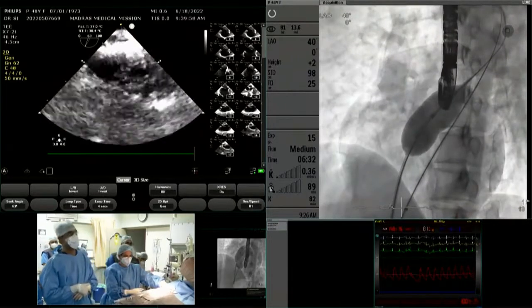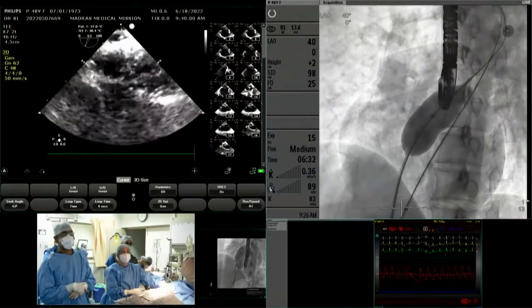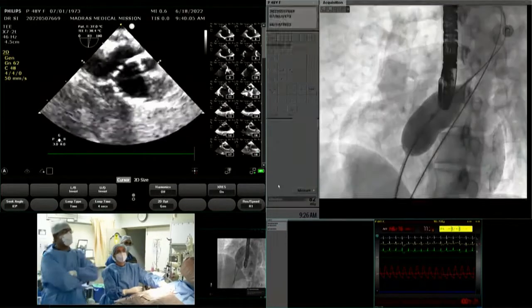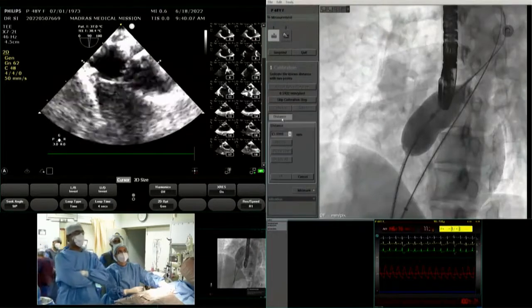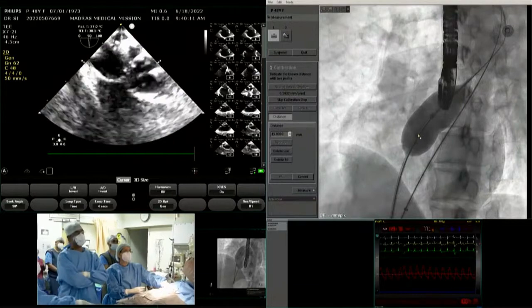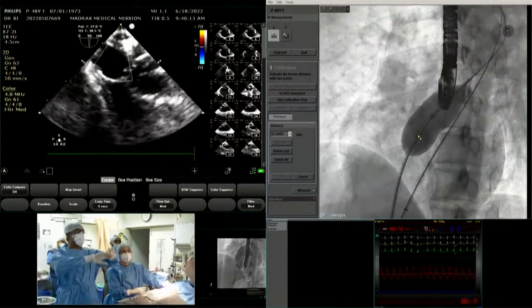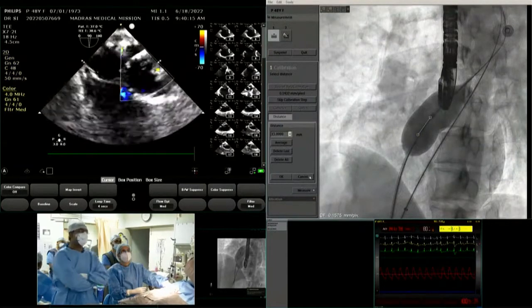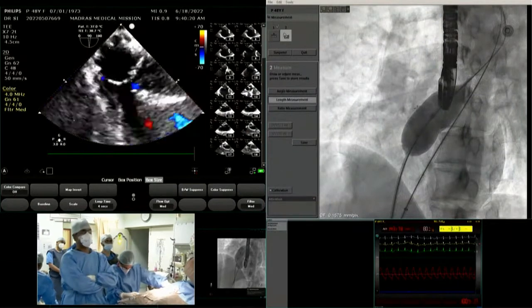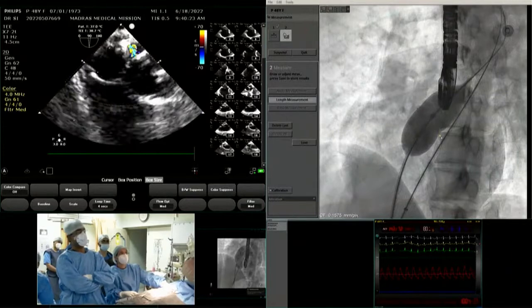Can you show in 90 degrees? Because the entire heart is occupied by two balloons, we can't see the interatrial septum. Can you show in multiple views, 90 degrees? Pramod, 90 degree color now. What has happened is we have bigger balloons than the anticipated sizes, the 34 and 24, so probably that could be the reason. Pull out, superior vena cava. Yes, so pull out to the superior vena cava.